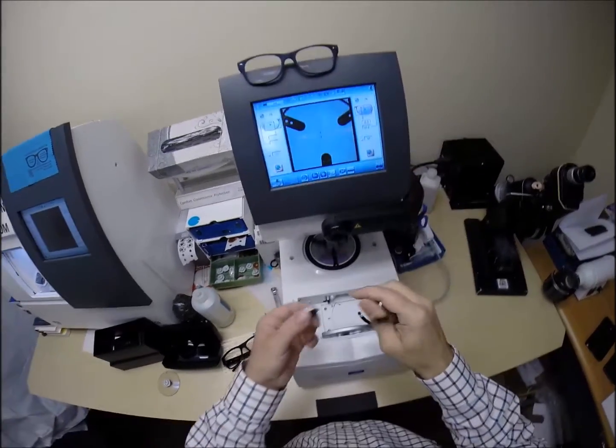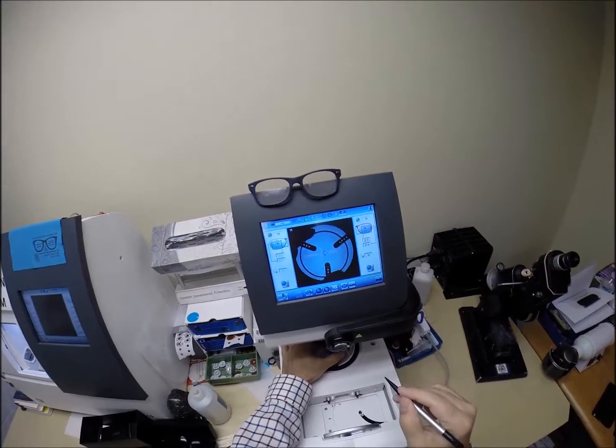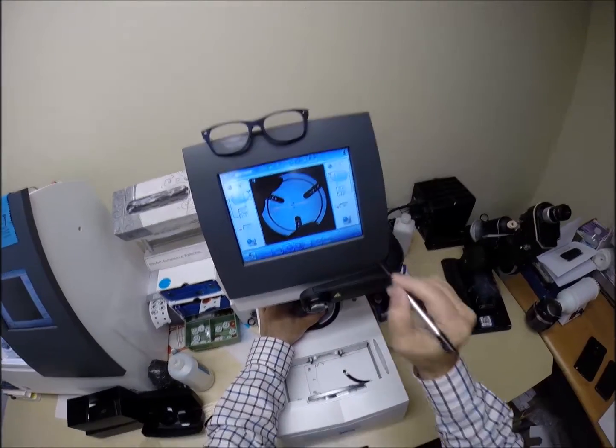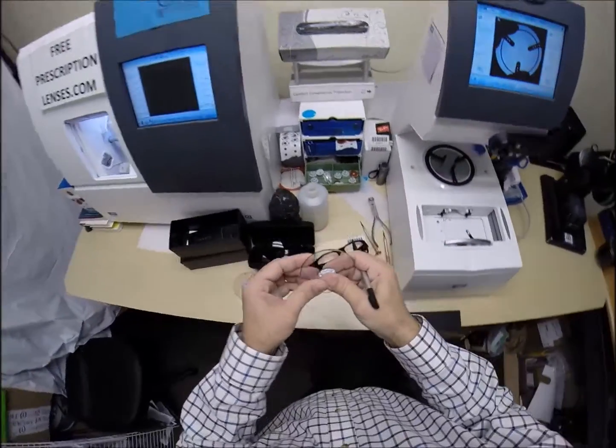Go back over to the left lens. Put the magnet in there. Line it up. Make sure everything is large enough to fit. Hit start. And now that is stuck onto the left lens.